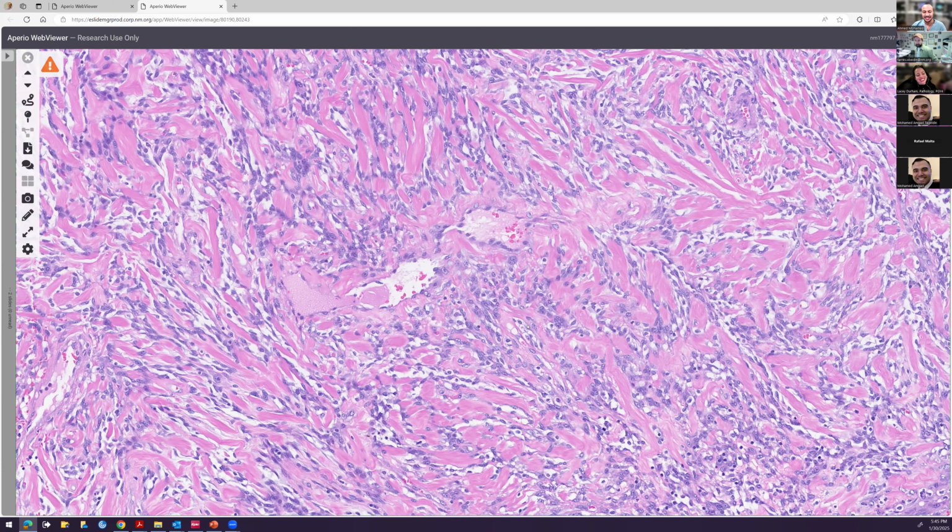But there are some tumors that classically have staghorn vessels. So what are the classic ones? Solitary fibrous tumor, which used to be called hemangiopericytoma, which is also where we get hemangiopericytic vessels, which is staghorn vessels. The two are one and the same. Solitary fibrous tumor. Okay, what else?